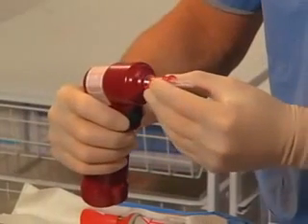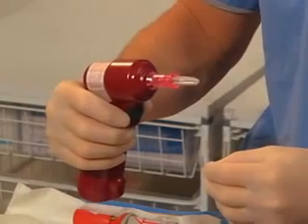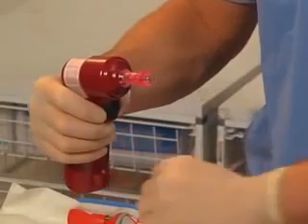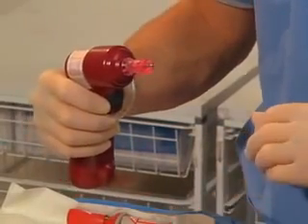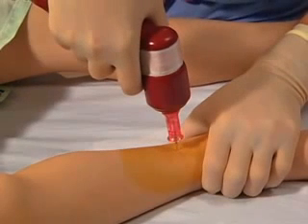Attach the needle set to the driver, allowing the magnetic pull to hold it in place. Turn the safety cap clockwise to remove it. Pull it off the needle. Place the needle against the skin overlying the site, 1 to 2 centimeters from the adjacent physis.